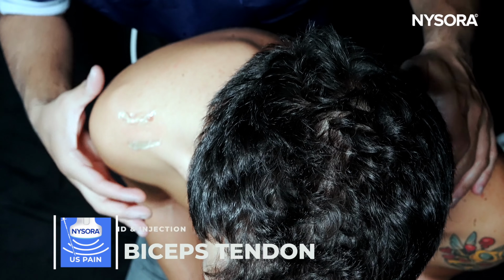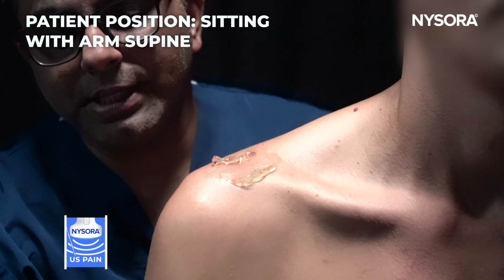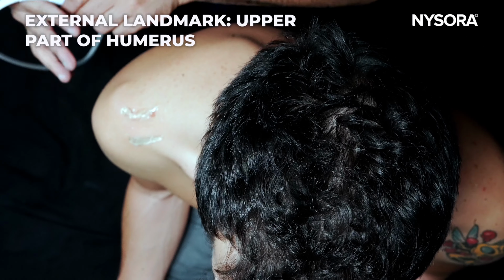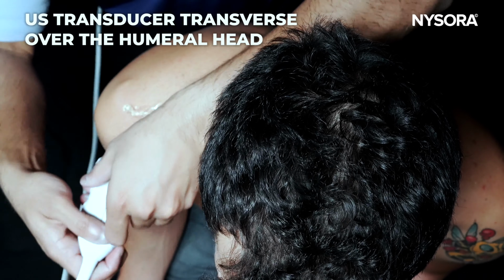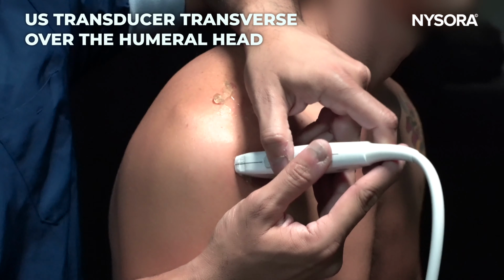Going to show you the bicep tendon peritendinous sheath injection. To perform the procedure, the patient will be sitting with the arm supine or in a neutral position. You will feel for the upper part of the humerus, and you will be bringing the ultrasound probe, resting it on the top of the humeral head, looking for the tuberosities.